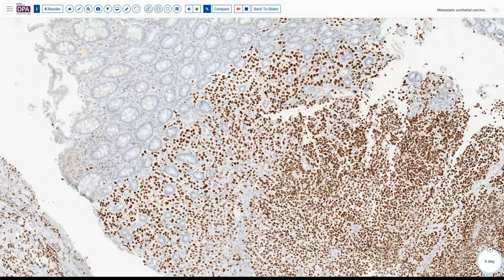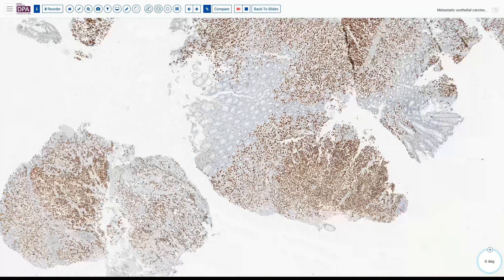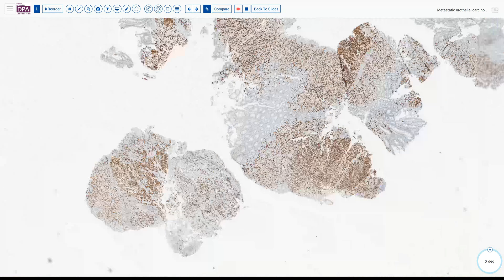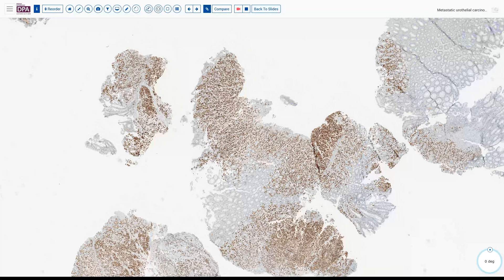GATA3 is not entirely specific for bladder — it can also be seen in many breast cancers and some squamous cancers. But in the setting of a patient who has a history of a prior upper urinary tract lesion and now presents with a similar appearing lesion in the colon, we come to the conclusion that this is a metastatic urothelial carcinoma with signet ring type morphology.